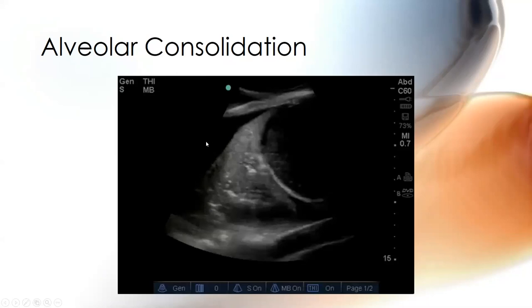So is it your place, quote unquote, to tell the doc, hey, I think there's fluid in the belly? Sure. This is part of your exam. I mean, anybody can see ascites, like the belly's out to here, and I can try to ventilate this person with 20 of PEEP, but I think you need to do a paracentesis. I think that's very reasonable. I would not be offended. Some of my colleagues, who may or may not be here physically, I know sometimes there's concern to speak up about stuff. Like maybe there's some fluid. You should be able to say with 100% certainty that there is or there's not fluid in the belly or in the chest after this talk, putting your probe on the patient.